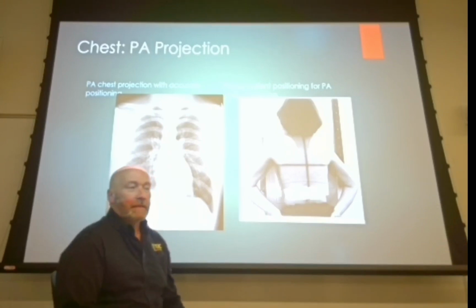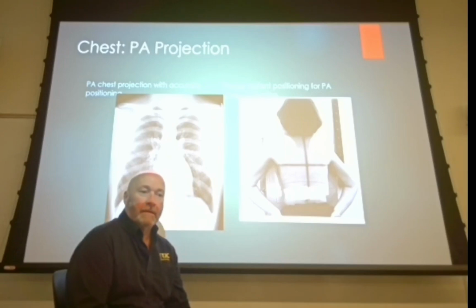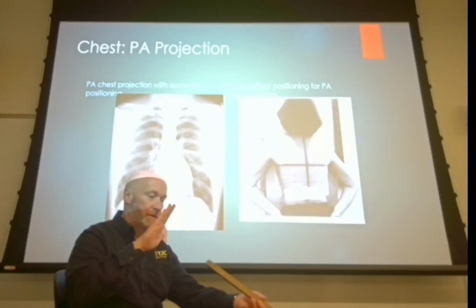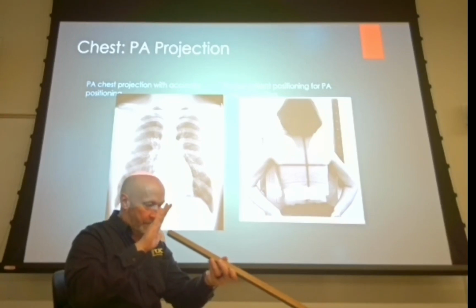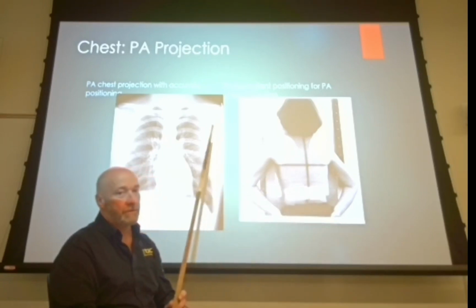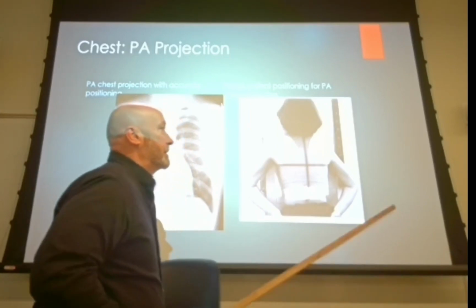So I've had patients who were so kyphotic, and when I set them up, you know, their sternum was at an angle more like, instead of straight up and down, more like this. I've actually had to angle upward into their chest, put the x-ray tube at the foot of the bed, drop it below the foot of the bed, and angle upward into the chest to get a decent looking chest x-ray. Okay? So that's the other thing you're gonna look for, is kyphosis.